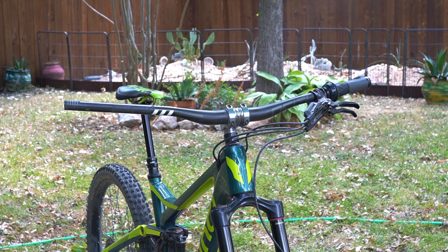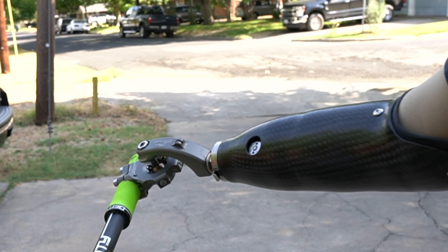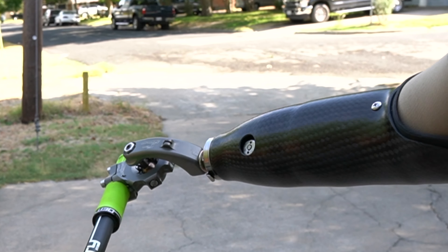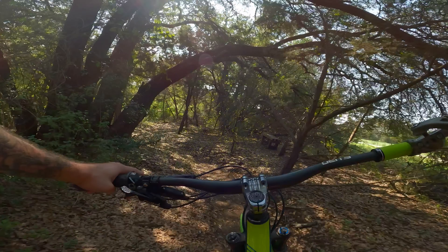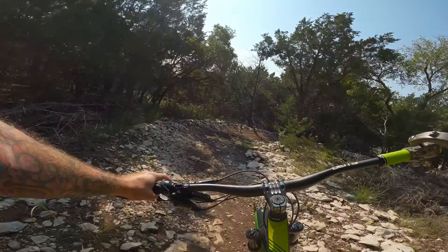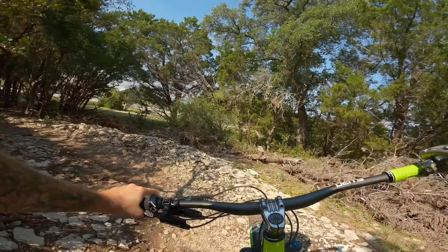I still have to improve the cockpit by adding a new grip — I matched the bike this time and picked out an obnoxious green one. There's a problem with the prosthetic though: the quick release button is attached to the inner rubber liner, not the carbon part. So as I'm riding, the liner flexes, goes beneath the carbon, gets pressed, and my arm pops out. I dropped it off to get reworked. Three weeks later — it's way better, exactly what I needed and my arm stays in. I'm still a little squirrely from having all that extra range of motion, so I'm going to have to get used to not having my arm basically secured at one angle permanently to the bars.